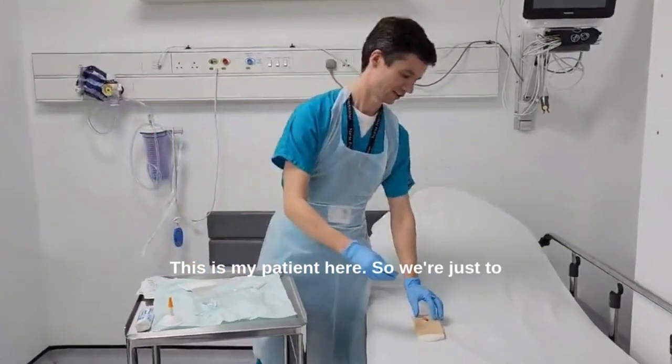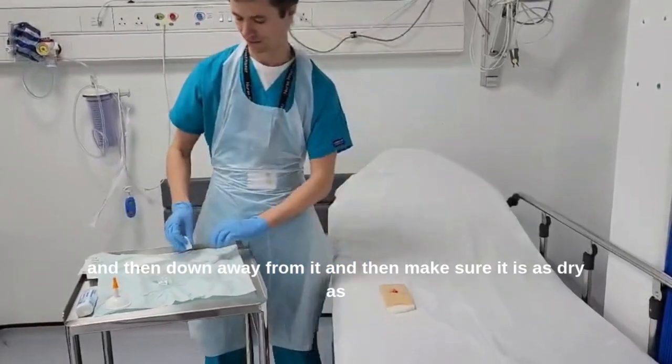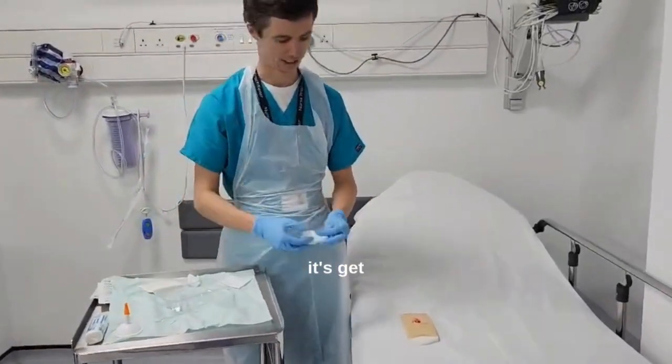This is my patient here. We're just going to clean the wound around it, then down away from it, and make sure it is as dry as it's going to get.